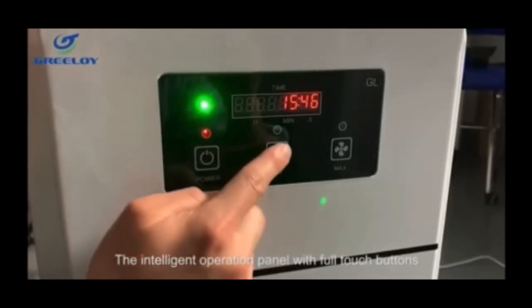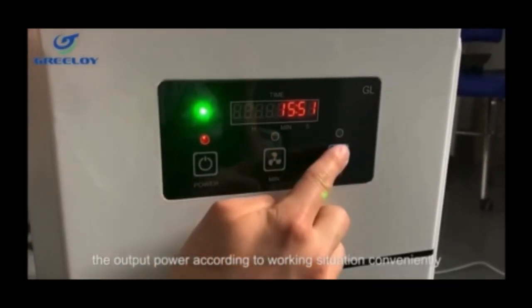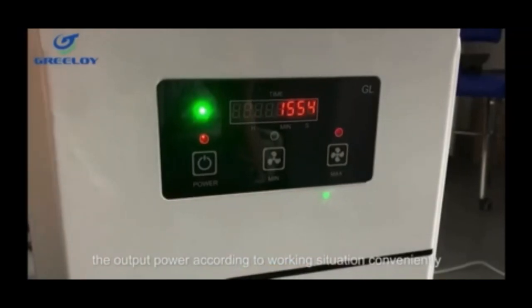The intelligent operation panel with full-touch buttons allows you to adjust the output power according to the working situation conveniently.